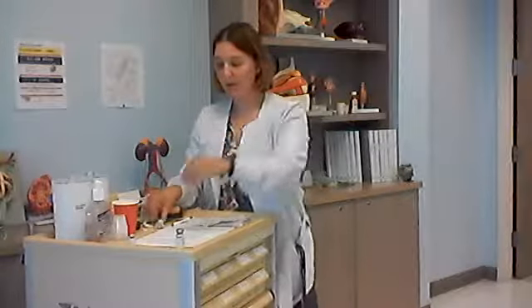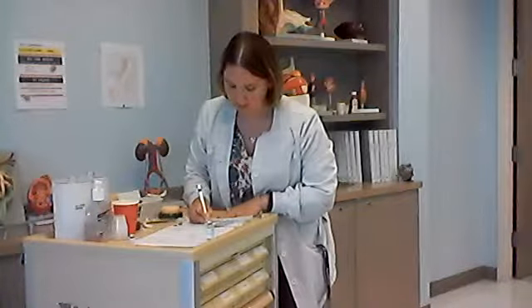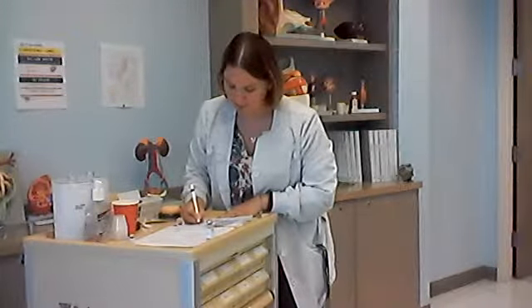Safely recap your needle. And then at this time, I changed my needle. For an IM injection, you need a new needle to puncture the muscle. Okay, so I've changed my needle. This goes in the sharps. And I'm going to do my second check as I write my label. So I have Mr. Terrence Walker, 15461.